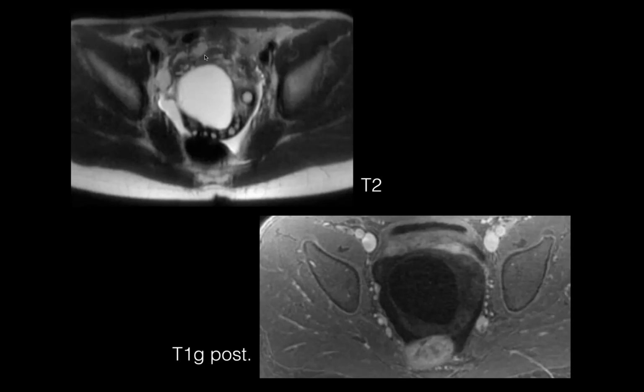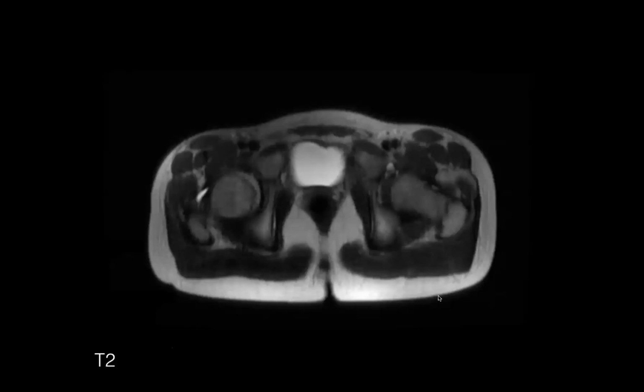You see the ovarian edema, that suggests that there's torsion, but this post-contrast exam that shows no enhancement really says this is probably not a viable ovary. So no blood supply, I guess, right? Yeah, no blood supply. It's sort of twisted off here.